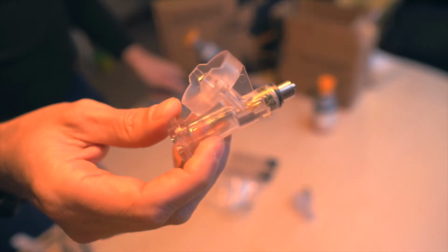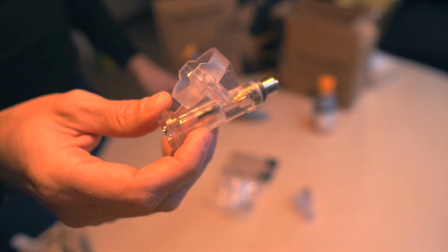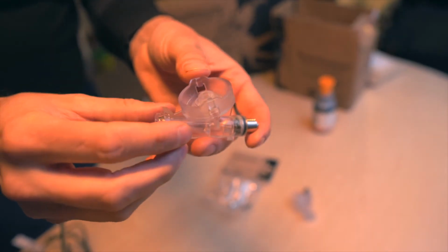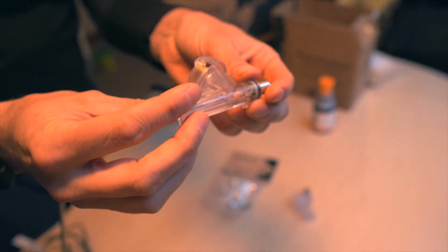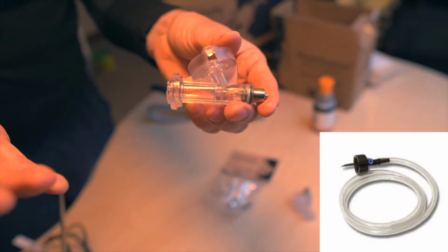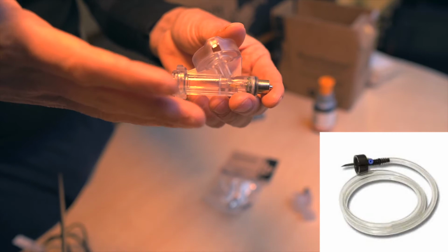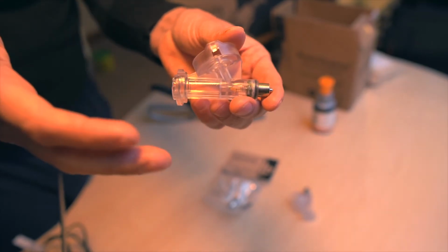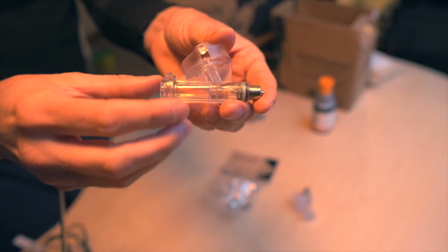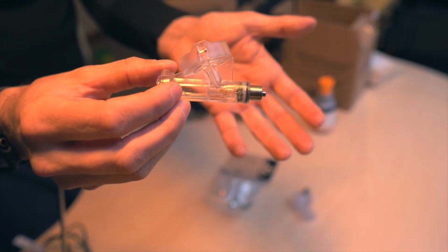And the fluid junction is something that we've always seen as an annual replacement, or if you're doing big numbers, it would certainly be something that you'd want to have some spares of. It's a semi-replaceable, just like the vaccine draw-off tubes that you have in pillow packs. Because the fluid is running through this, you want to keep it hygienic and clean so that the product that you're injecting into the animal has the best hygiene possible.